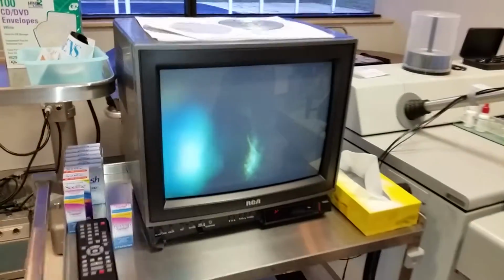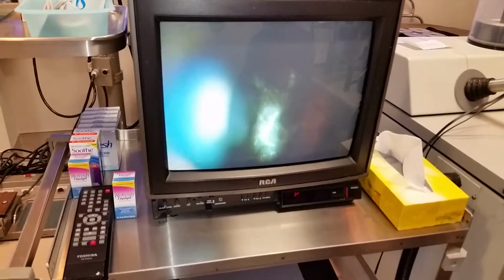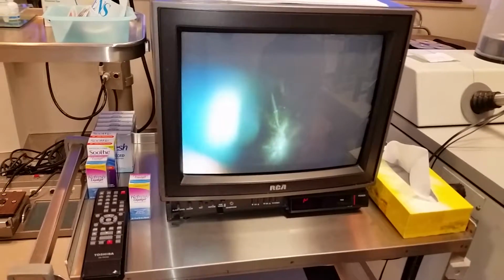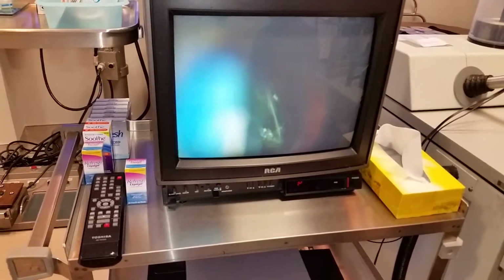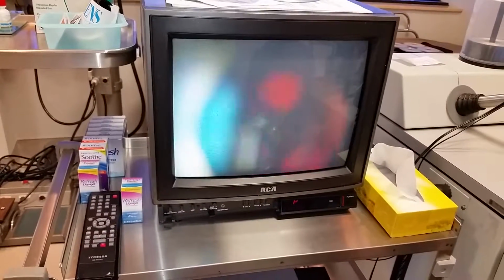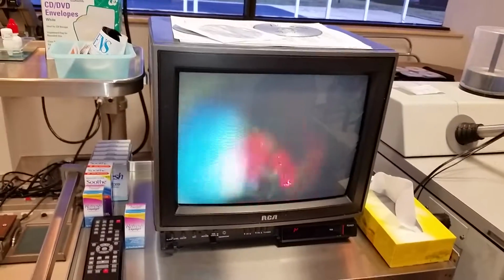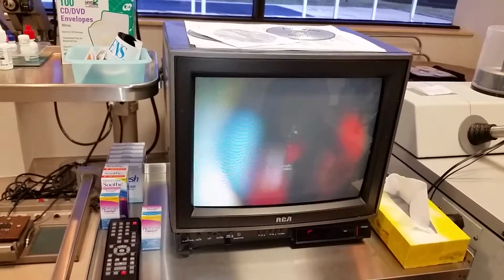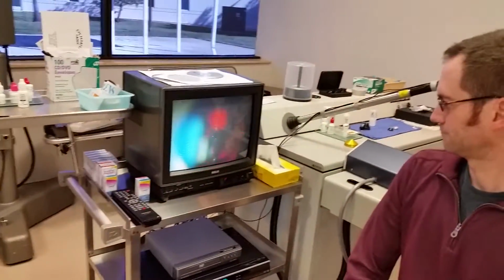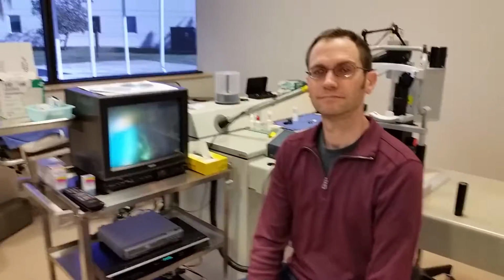Here we go. Yeah, this is a fibrillar mass. It looks like a giant cotton ball sitting in the center of the eye, and if you can't see behind it, you can't see through it. And there's the little suspending strands. We're using a little tiny bit of laser energy to cut spider webs. And I guess that's what we are: spider webs, water, and a few little cells that actually are self-aware. But we did this several times. We got that out of the visual axis.